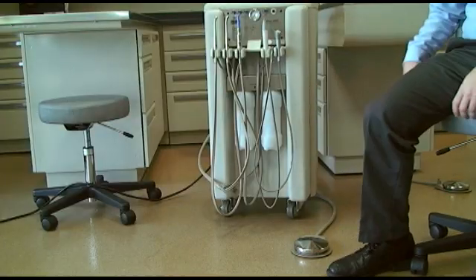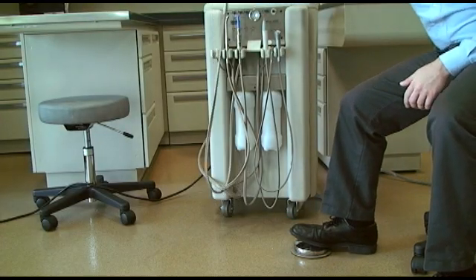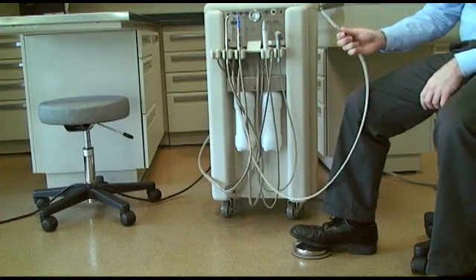On the floor, you'll find a foot control that opens a throttle valve to allow air and water to flow to the VetPro 1000.